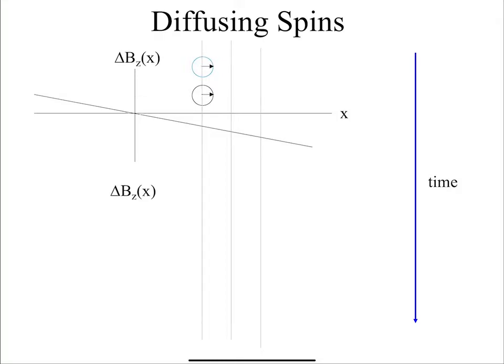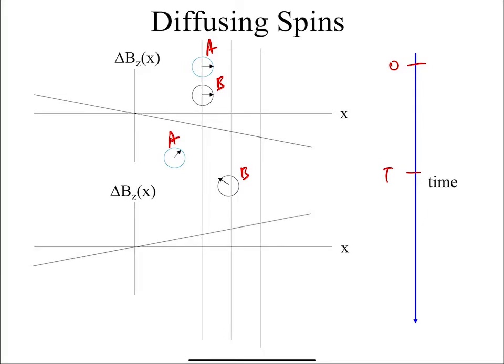So how do we measure diffusion in MRI? Well, it turns out it's very similar to how we measure velocity. It's just the way we interpret it that is different. Okay. So once again, we're starting off with 2 spins, A and B, but now we're going to assume that they're both moving. Okay. So they both accumulate net phase. Okay. And then from time 0 to t, we have a negative gradient, and then from t to 2t, we refocus the gradient. But since these guys are moving around, they're not going to be refocused perfectly, so they're all going to acquire net phase.